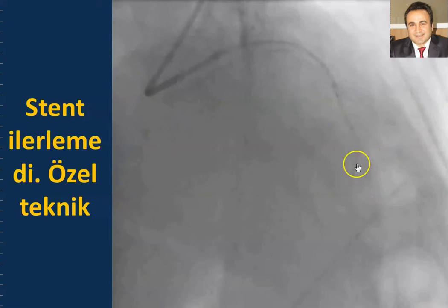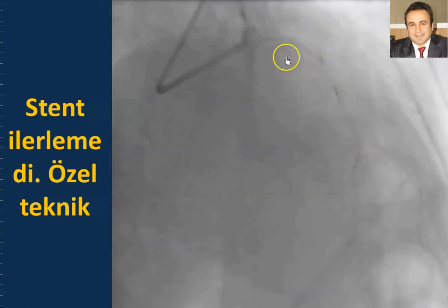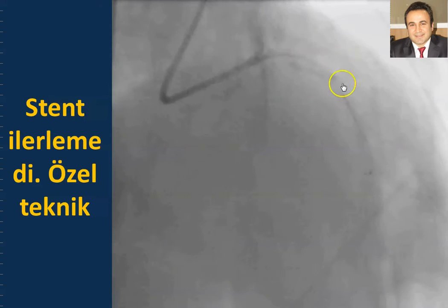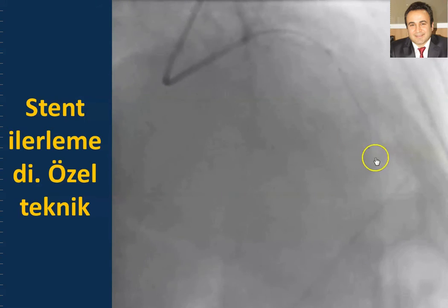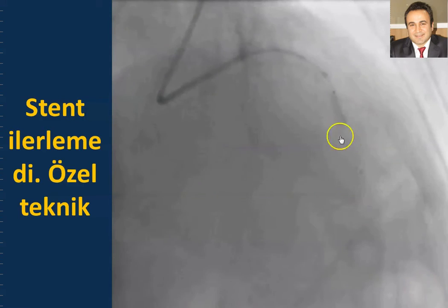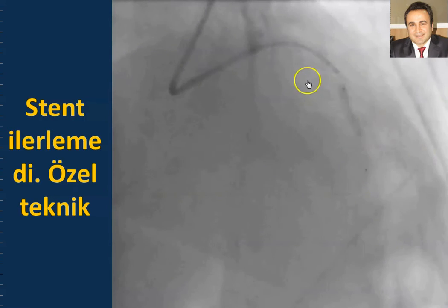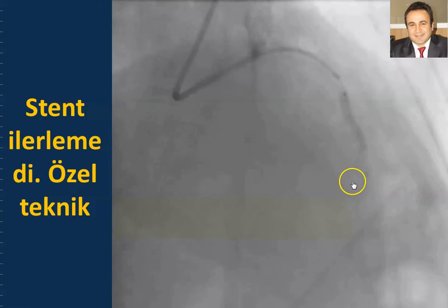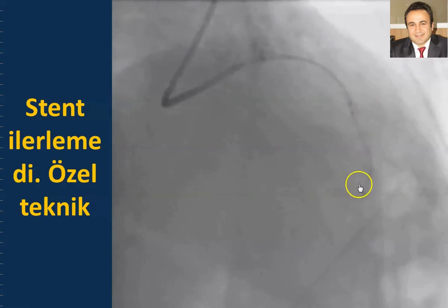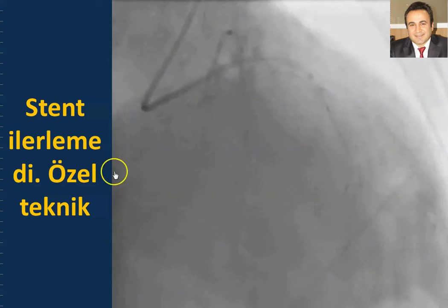By the help of coaxial anchoring, we cannot see it at this picture, but we delivered the catheter extension at this point because we could not succeed to deliver this stent to the proper position. We first delivered the catheter extension and then the stent, and we pulled back the catheter extension and dilated the stent.